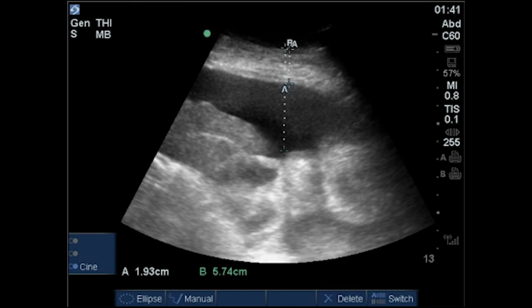On the frozen ultrasound image, the operator then places two calipers, one measuring the minimum distance of needle insertion from the skin to the parietal peritoneum, and a second measuring the maximum safe distance of insertion from the skin to the underlying organs, which may be bowel, kidney, urinary bladder, etc.